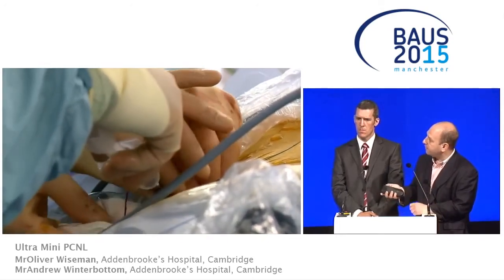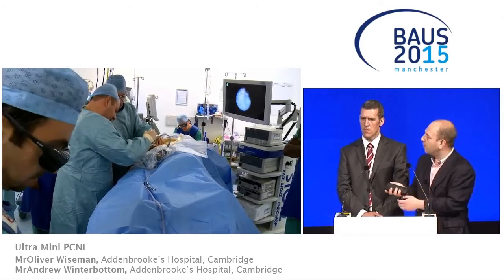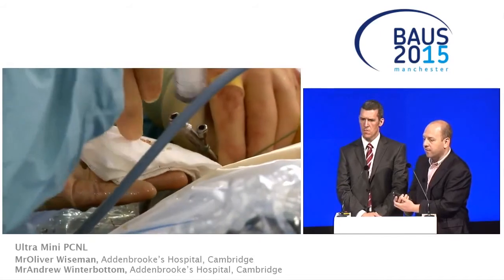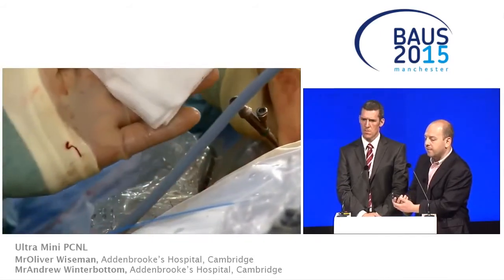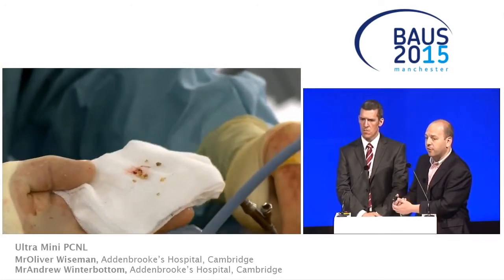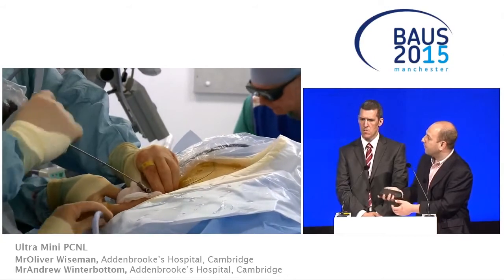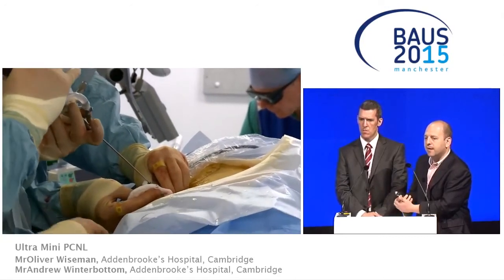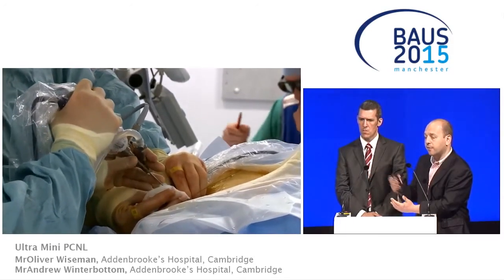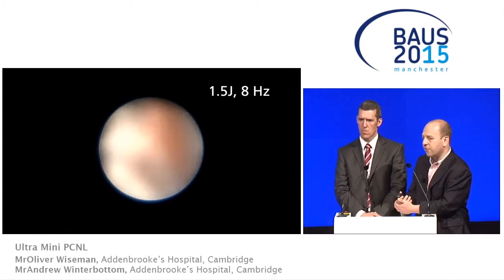And you can see now, just to interrupt, we're flushing the fragments out through this side port. We've got a little swab to collect the fragments on, and the fragments do wash out quite nicely. I was a little bit sceptical as to this Venturi effect and whether it would actually work. So if you believe that this idea of the stone fragments going from high pressure to low pressure is actually true, then if you use your ureteric catheter to flush up and get the fragments out, and you're also flushing through this side port, then I think if you've got fragments elsewhere in the kidney, they will be flushed out from this, as I say, low pressure area, from the high pressure area to the low pressure area. So yes, a bit concerned, but I don't think that's proved to be an issue in the cases that we've done.